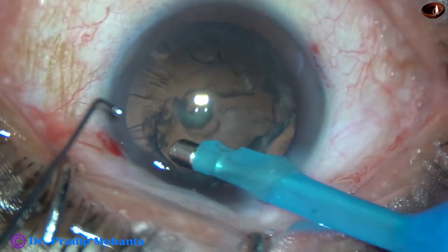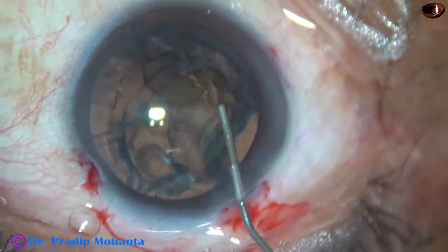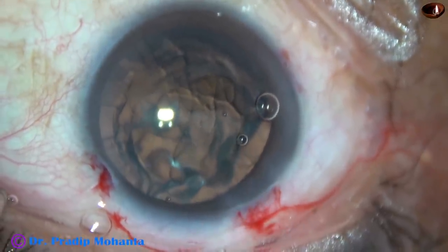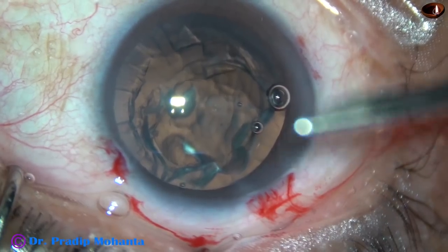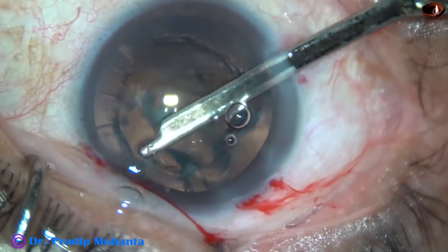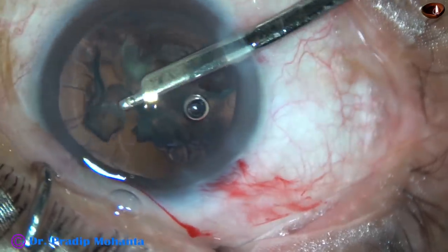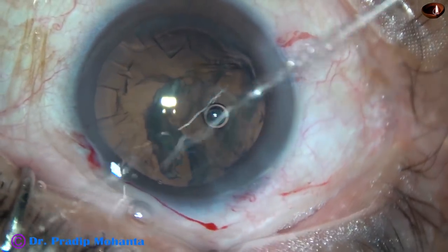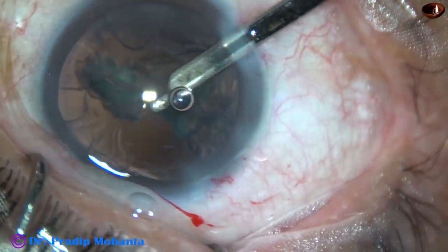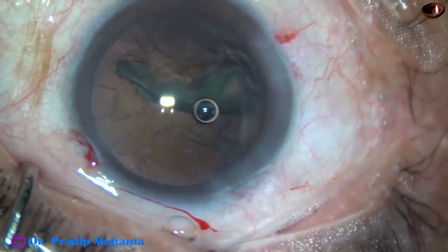I am surprised, and you will be more surprised — even after three decades of surgical experience we do such blunders. And now I am trying to correct and trying to repair the damage. I have taken Viscoat from Alcon and I have plugged the tear. And now I am trying to pull the epinuclear sheet. And here this is blunder number three — I tried to pull the sheet even when I saw the tear. Here, blunder number four: I am pulling the vitreous strands. So this has become like a vicious cycle — I am doing one blunder after another.